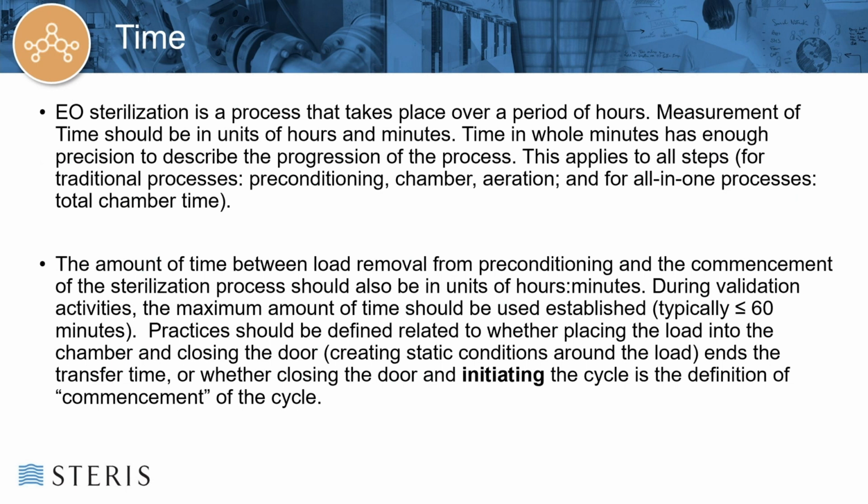So you can look at the heat history that you have in the testing for the product to determine whether or not you need an upper limit at some point for the process. The minimum time, however, is a little more tricky because the amount of time during the dwell phases for humidity or conditioning and EO dwell will greatly impact the lethality of the process. So overextending the process probably doesn't impact lethality, it would impact function. Under-processing can impact lethality. So you want to make sure that your minimum time is based on data that you've collected from your sublethal cycles.